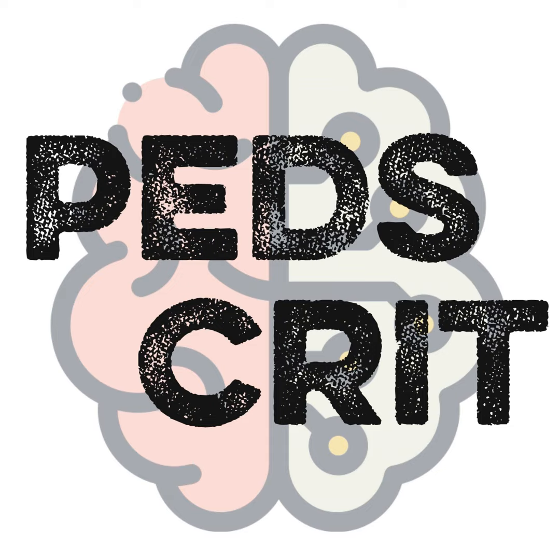This escalating PEEP strategy is relatively safe in that I shouldn't cause a pneumothorax. I shouldn't cause major cardiovascular instability. The downside of it is that it's super slow. It's super slow to recruit this way because every time the PIP goes up, a little bit more lung opens up. Whatever wouldn't open up at 25 might open up at 28, and now a PEEP at 12 might keep it open, okay? And conceptually, it's weird.